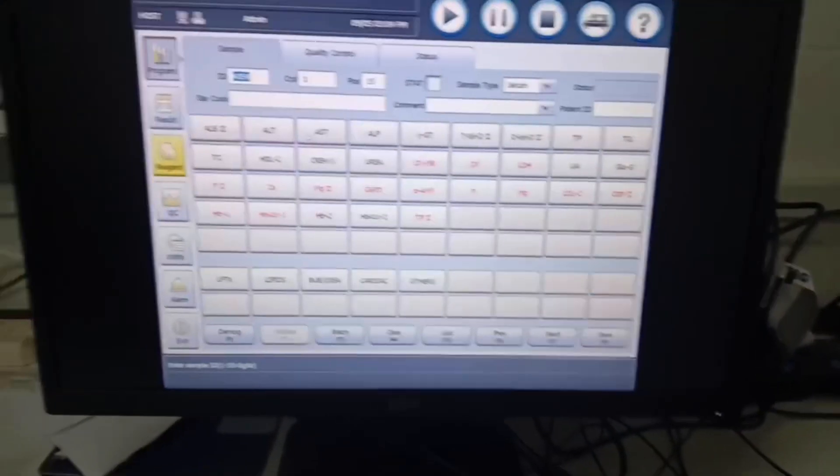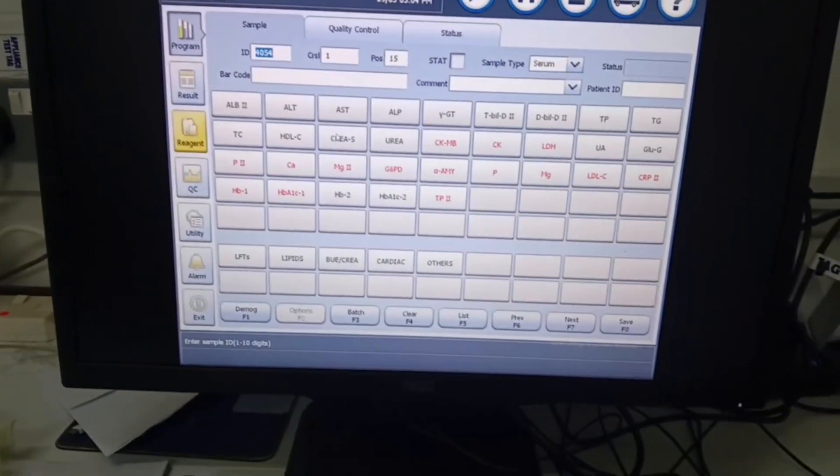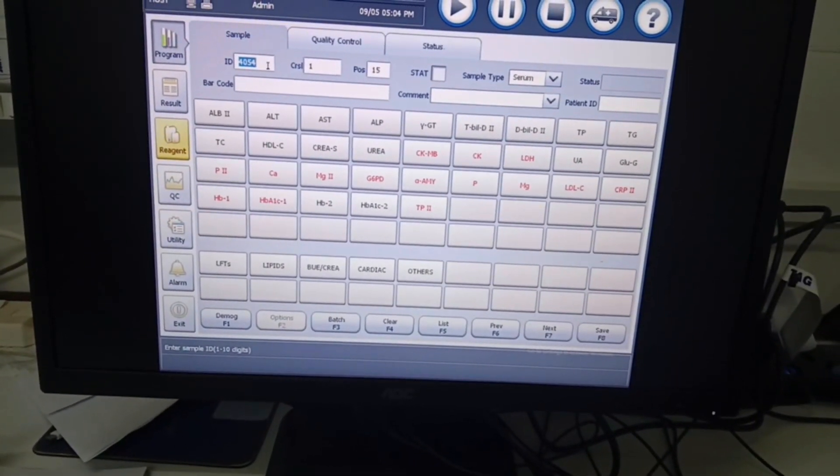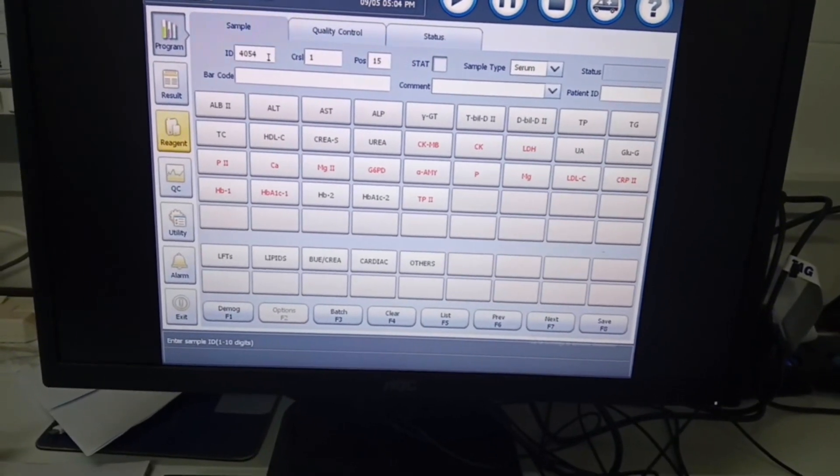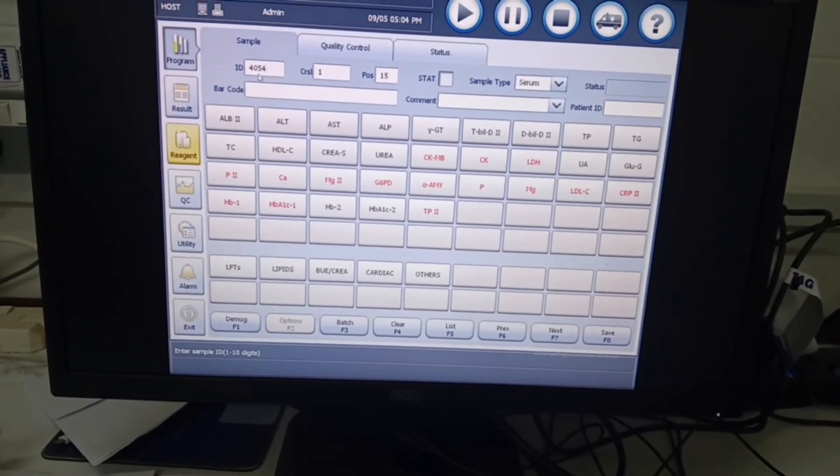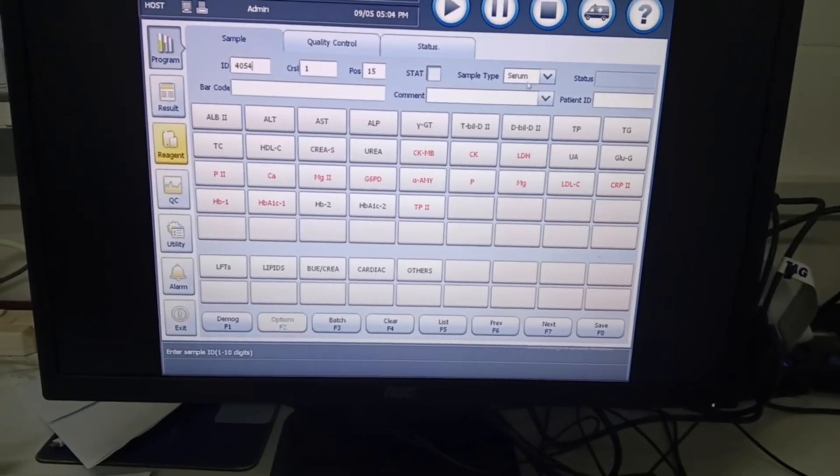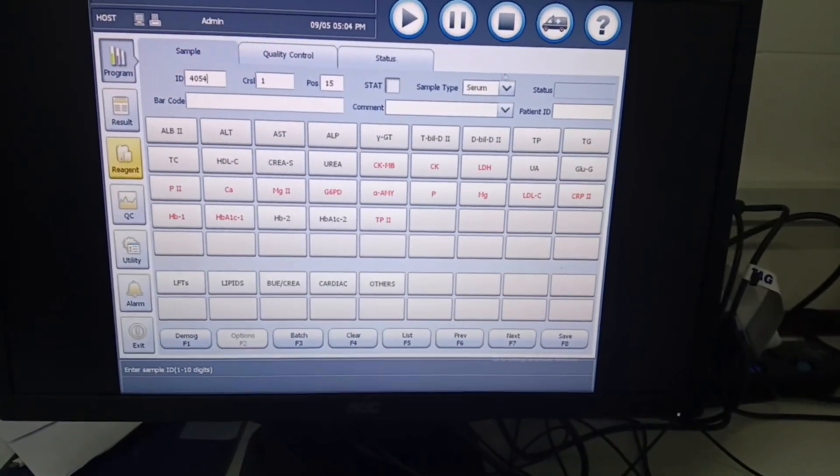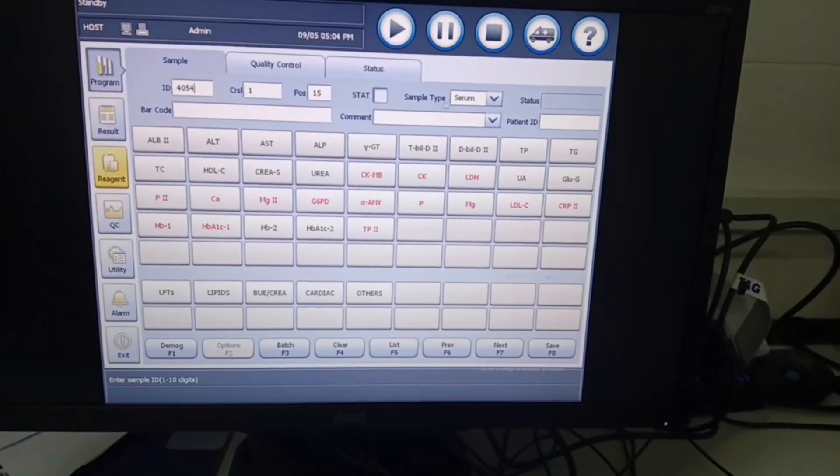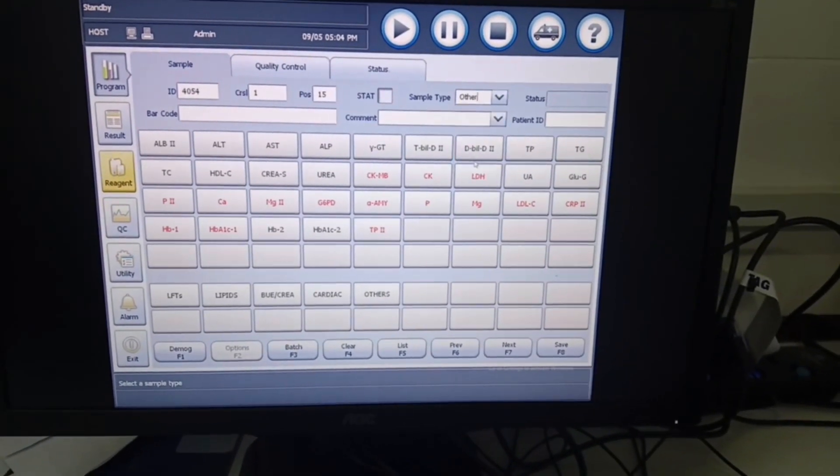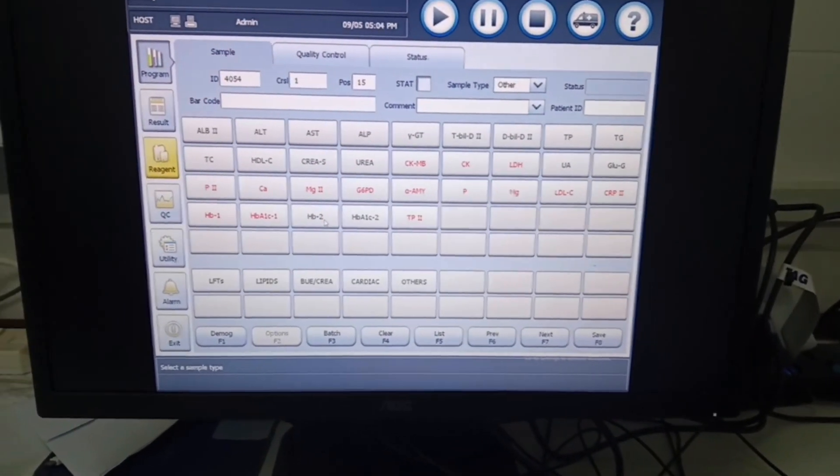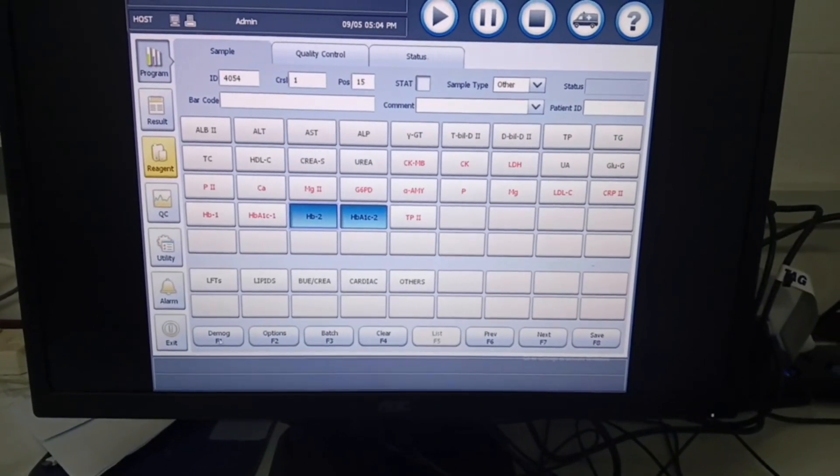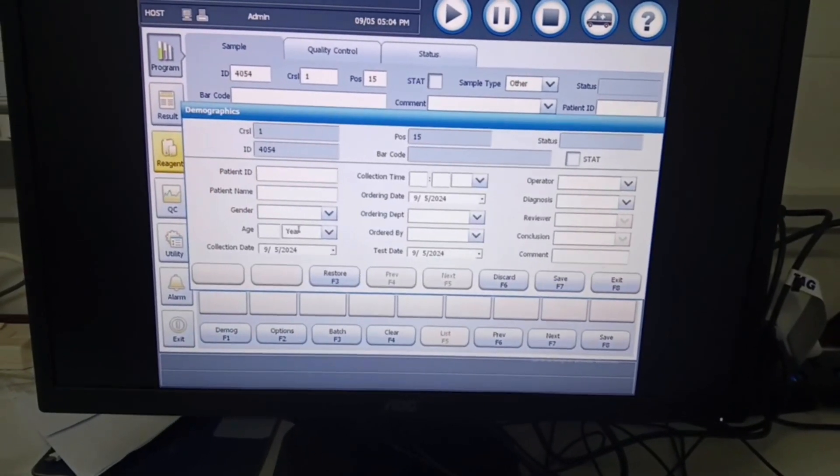While the sample is being centrifuged, we can input our patient details. The patient ID is 4054. We remember that with HbA1c we don't use serum, so we have to change the sample type to other. Then we click on the HbA1c test and click on do more to enter patient details.